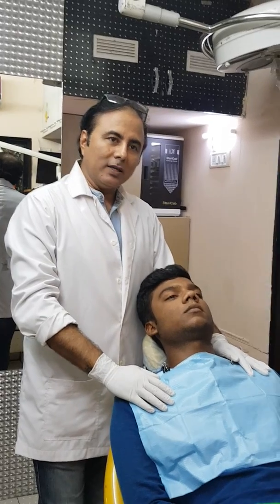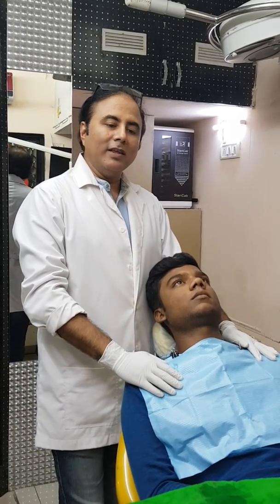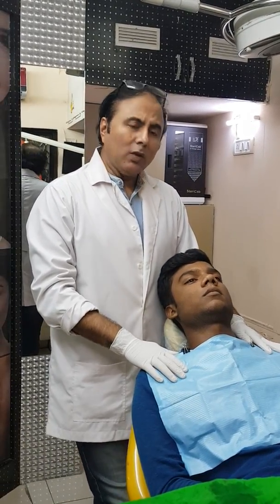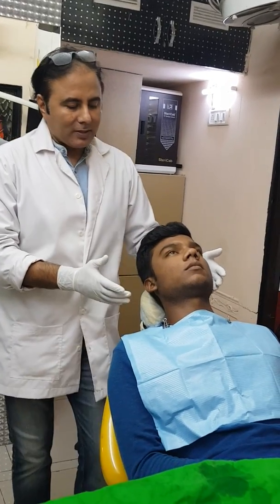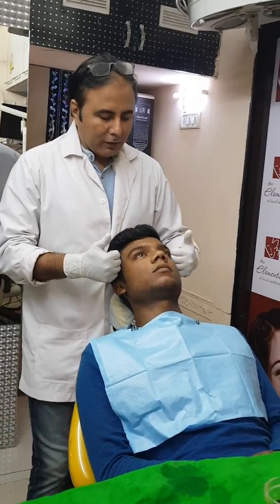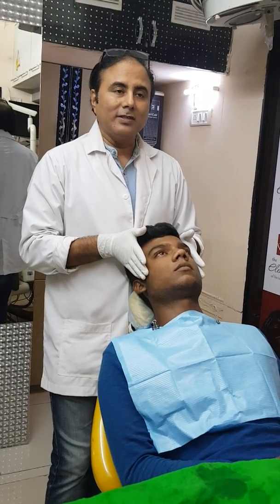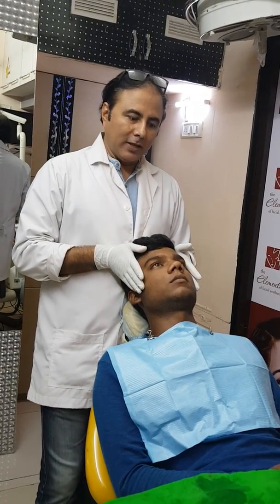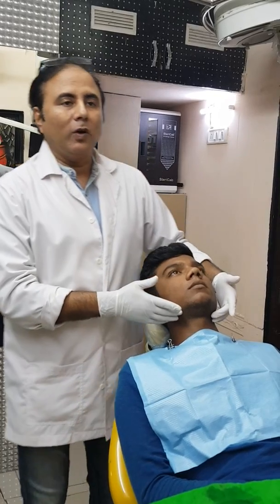He has consented to us to make a video to put on Facebook and YouTube. We are going to make a tutorial on how to inject botulinum toxin for this hypertrophy, which helps reduce it. Basically, an ideal good-looking face is an oval-shaped face. If we have a hypertrophic masseter, it becomes quite squarish. We measure the width at the forehead level, the mid-face level, and the jaw level — when all three are the same, it is a squarish shape and does not look aesthetic. This procedure contours the face to achieve an oval or ideal face shape.